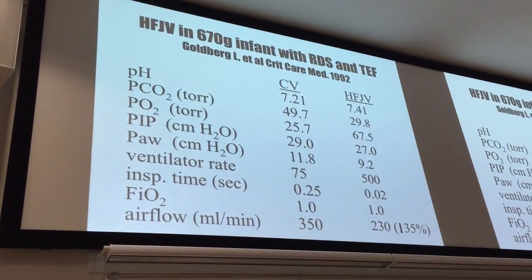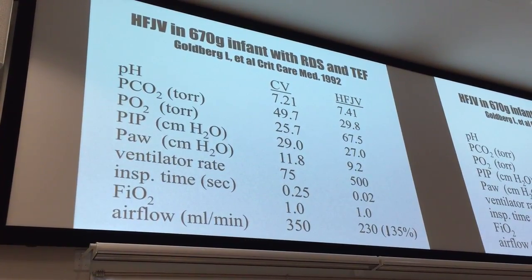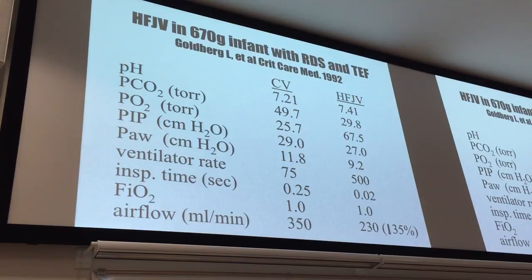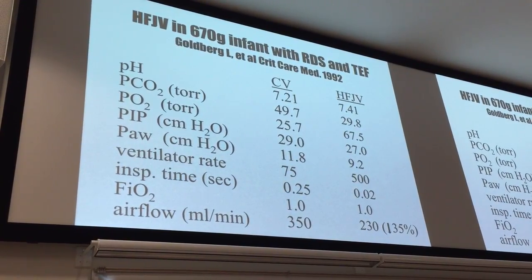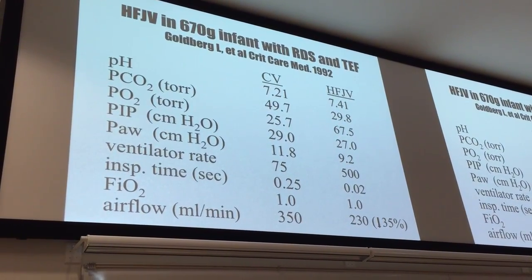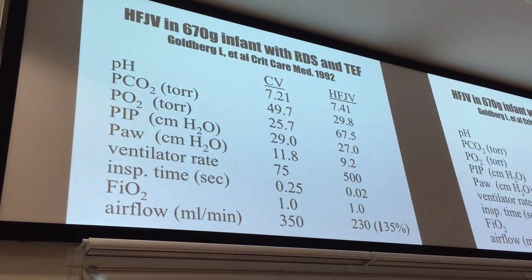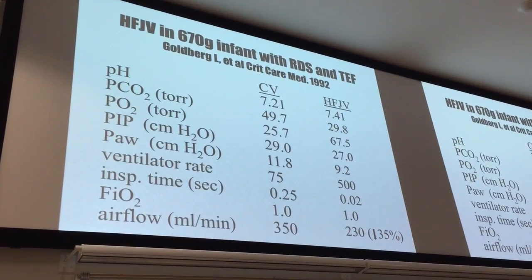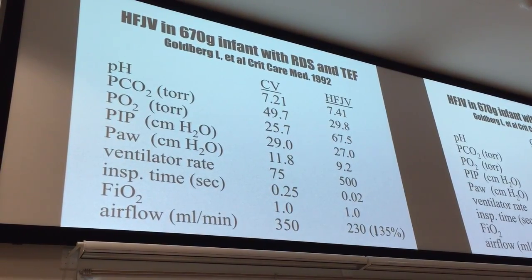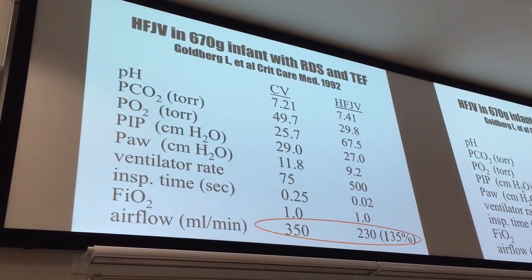But before we turn on the jet, I quickly measured, quick and dirty, just an inverted, calibrated cylinder stuck underwater, to see how much air came out in 60 seconds on conventional ventilation, and then switched to the jet. What we saw was obviously improved gas exchange, and not only that, lower mean airway pressure and quite a substantial reduction in flow. There was still some flow escaping, but certainly less. There's one other case report showing a similar thing. So anyway, it's a toy that works.